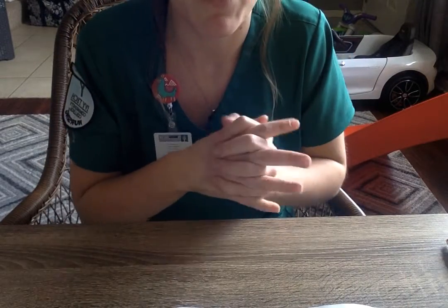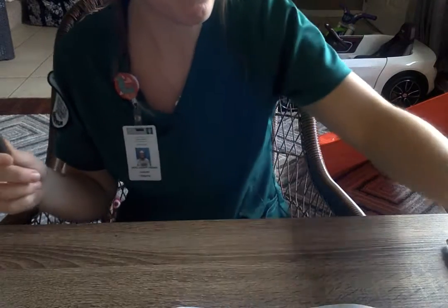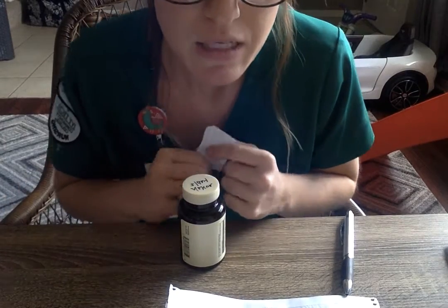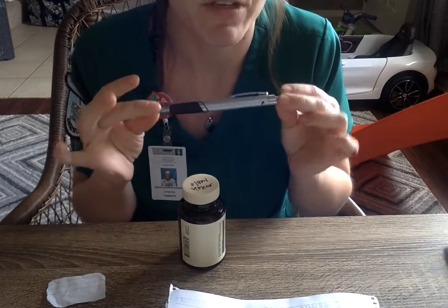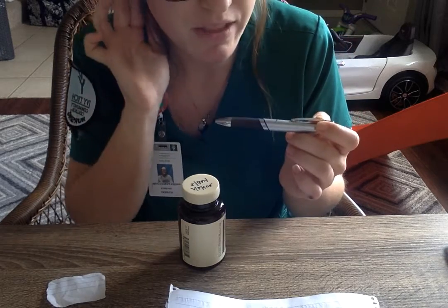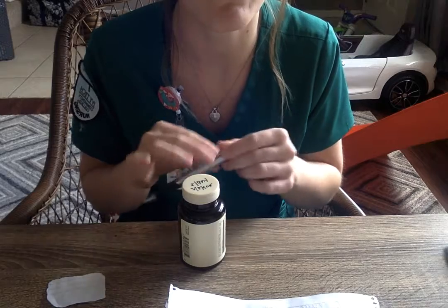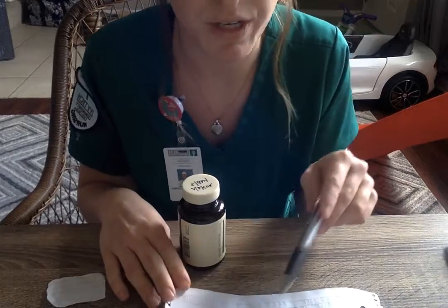Next, I'm going to be doing my Demerol, which is the meperidine hydrochloride, and I'm going to be doing this one intramuscularly. So, kind of the same thing applies. I have my vial here. Before I begin, actually, the kind of syringe that you want for an intramuscular injection would be an 18 to 27 gauge with a 1 to 3 milliliter syringe. And I know that if I were to use this in the deltoid area, I would not be able to do over 2 milliliters of medication, so I would have to administer them in 2 different injections. But that's only for the deltoid.